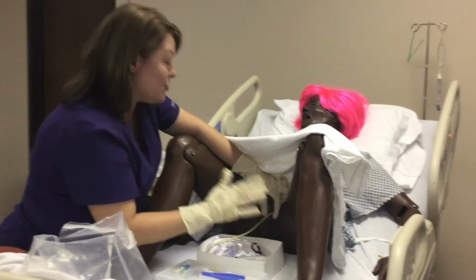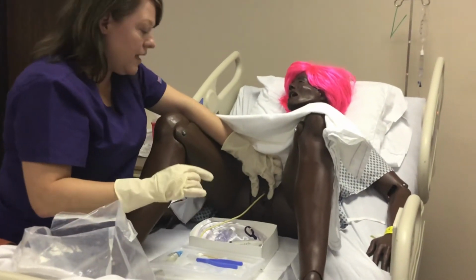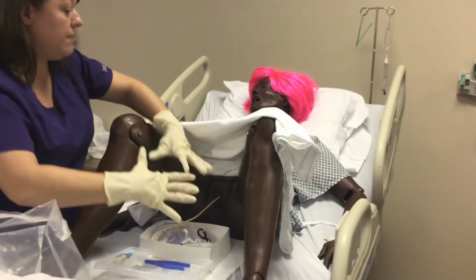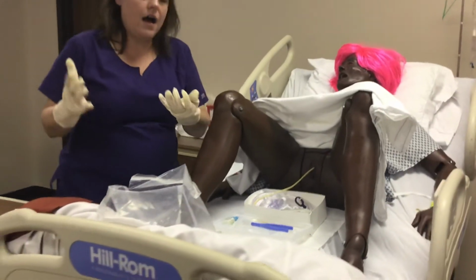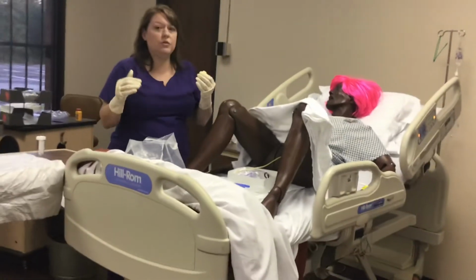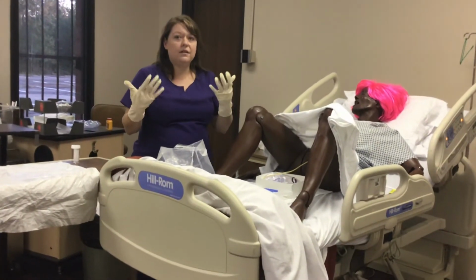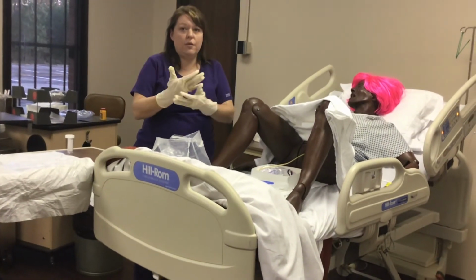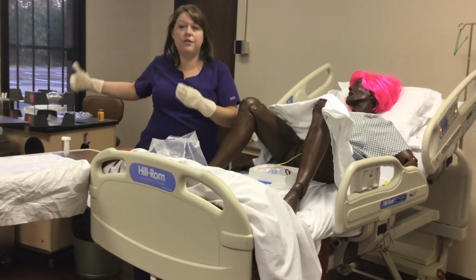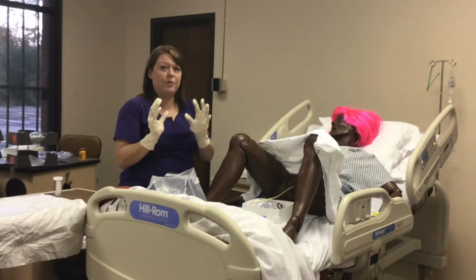All right, Miss Shelton, so the hard part is over. You did great. All I'm going to do now is I'm going to back away, all right? I'm going to tape the catheter to her leg. At this point, I would normally go ahead and take these gloves off and put other gloves on just because I feel better about that because I don't want to be touching her with lube all over my gloves.